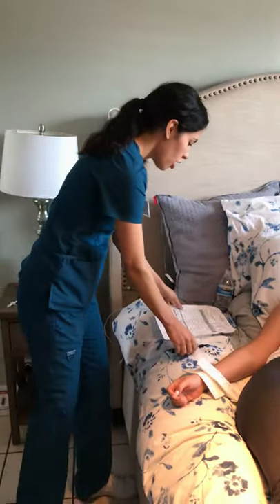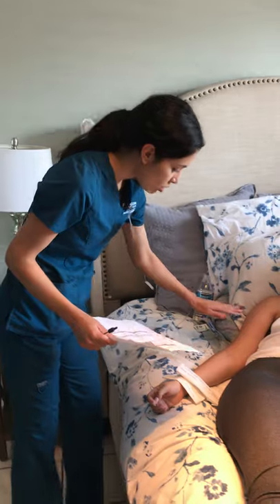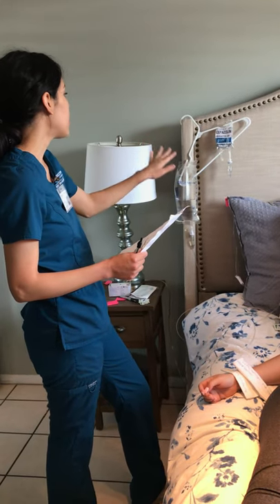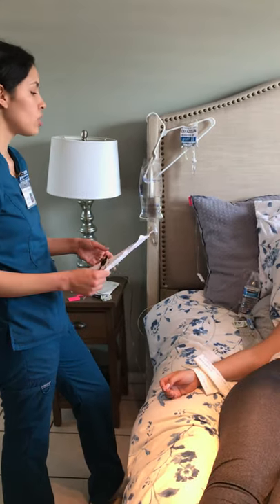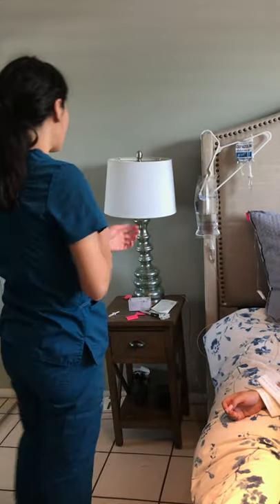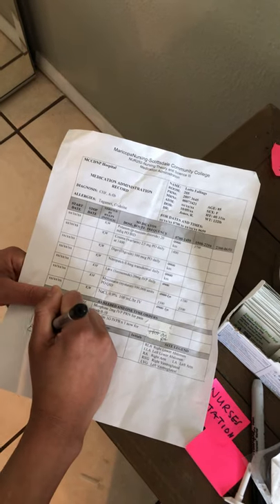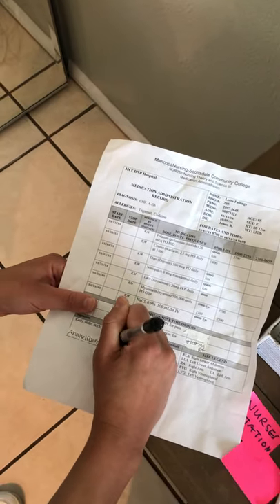I'm going to remove my gloves and wash my hands. Ms. Lotta Fallings, is there anything else I can get for you? No. This still looks like it's running okay. I'll be back in about 30 minutes to check on your Cefazolin and see if it's done, then restart your normal saline infusion. If you need anything, here's your call light. I'll wash my hands and come chart. I've charted the time, my initials, and the site, and crossed off the medication as given. I've written my full name, credentials, and initials — and I am done.